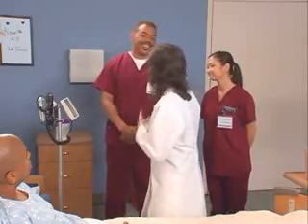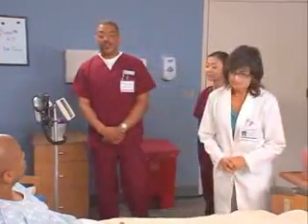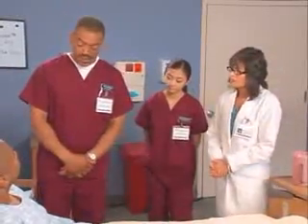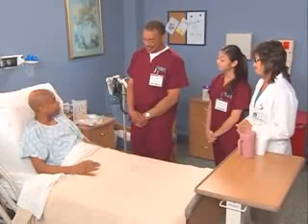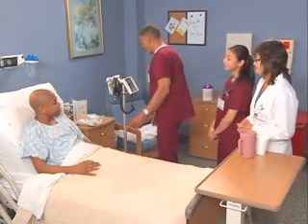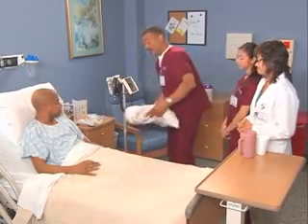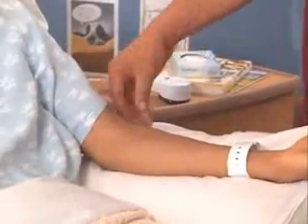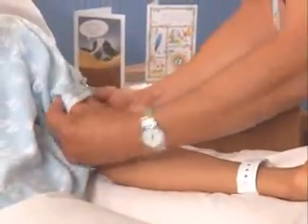Steve, why don't you assess the appropriate limb? Mr. Betts, have you had any injuries to this arm recently? No. Okay, any surgeries or medical procedures? No, my arms are pretty much a matching pair. That's good. Okay, well, why don't we get you comfortable? And place your arm like so. I'm going to roll your sleeve up.